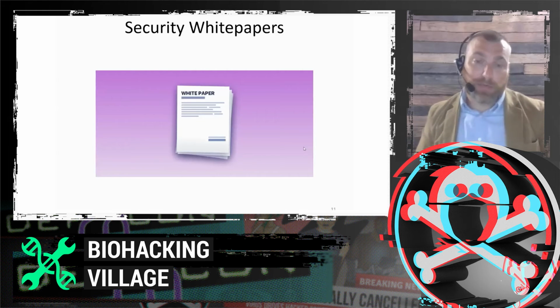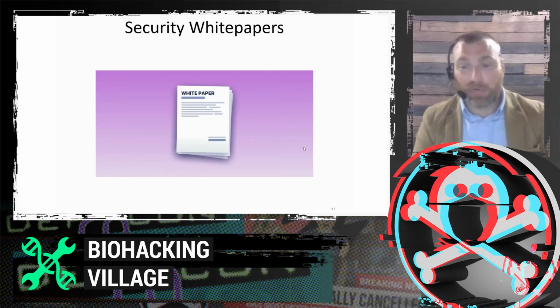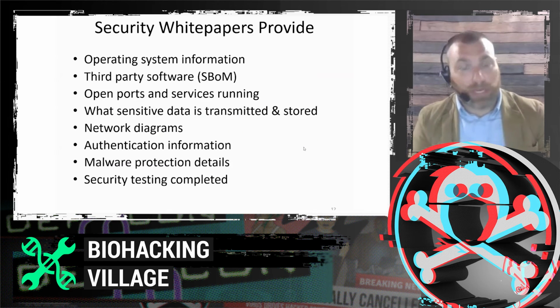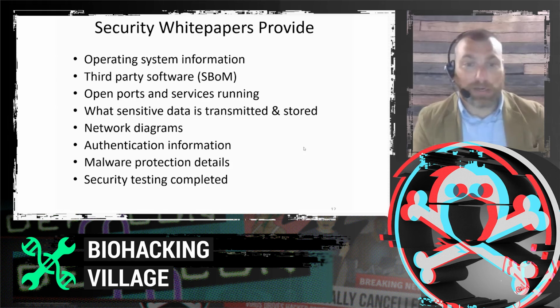So the MDS2 is a good place to get information. Security white papers as well. A number of medical device manufacturers create security white papers that offer a lot more information above and beyond what's in the MDS2. Some of that information, so you might have a full software bill of material, includes information like which ports are open and which services are running on the device, specifically what sensitive data elements are stored or transmitted on the device.